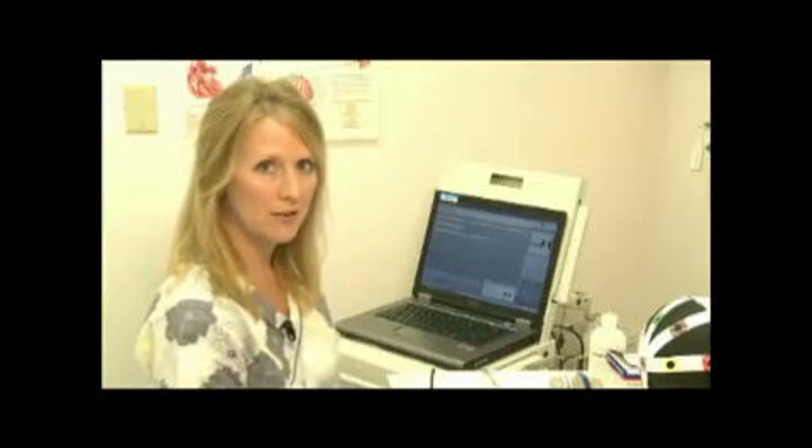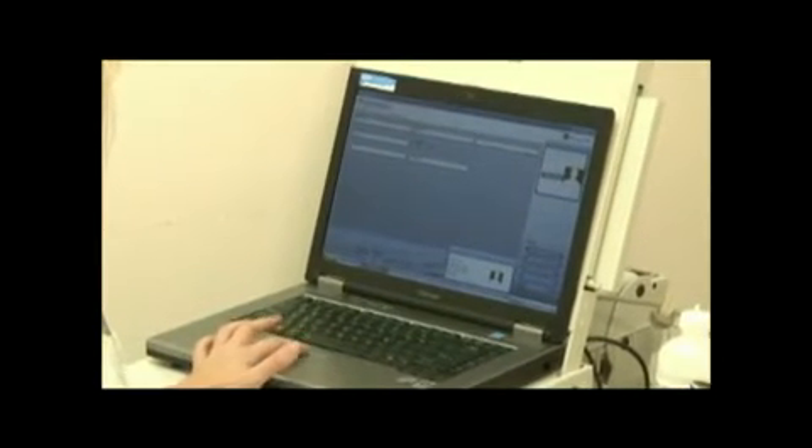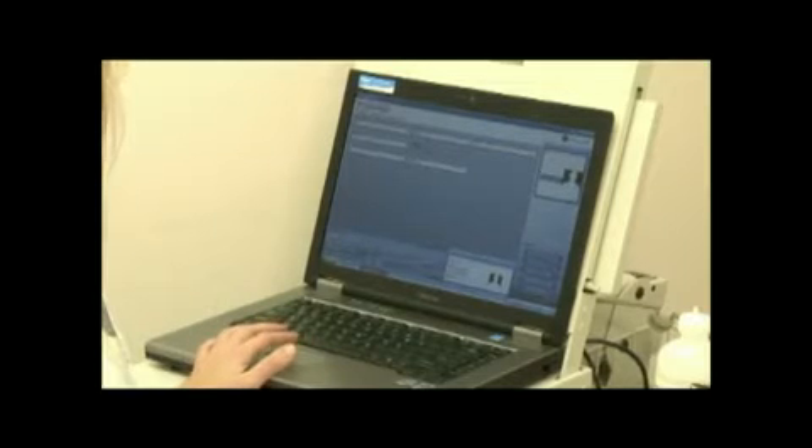Next you will set up the patient information screen and the patient history. Go to your EEG computer and select New Patient. Type the last and first name, the birth date, and the ID number. Once you have that finished, click on Start Ambulatory EEG. Now type in the patient's medications and the patient history. Once you have that finished, click OK and your Cadwell Ambulatory software pops up on the screen.